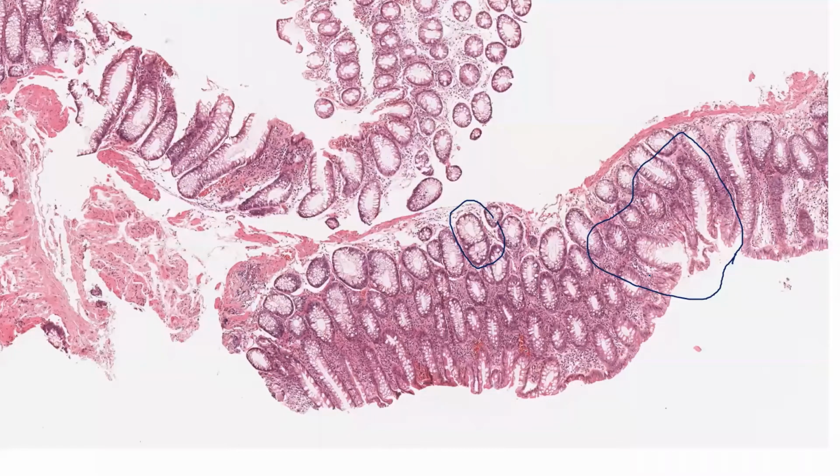In the setting of Crohn's, still there is slight angulation. You can take that or leave it here. That is fine, but you then have to weigh things, and then decide whether that is enough to call it minimal architectural distortion. I think it is enough.